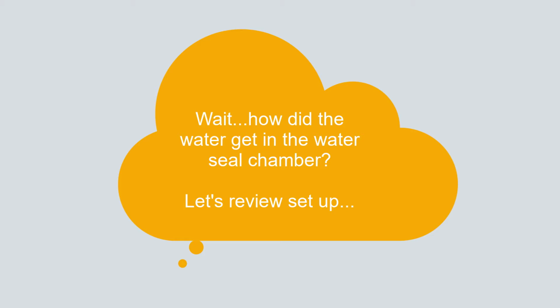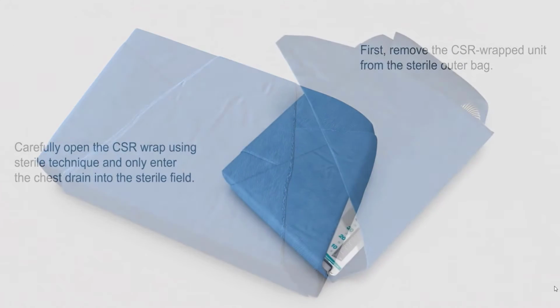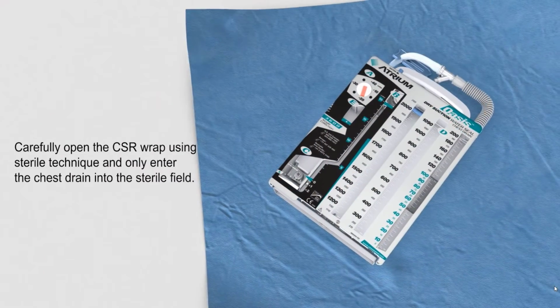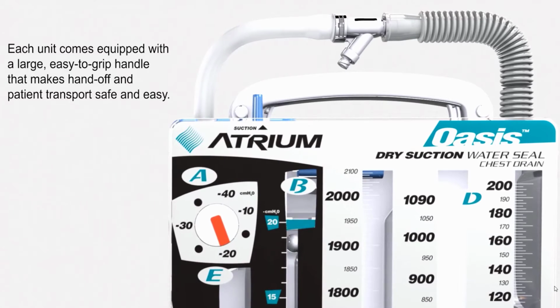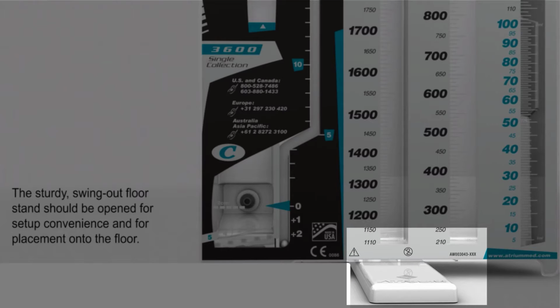Let's talk about chest drainage system setup. Remove the wrapped unit from the sterile outer bag. Carefully open the CSR wrap using sterile technique and only enter the chest drain into the sterile field. Each unit comes equipped with a large, easy-to-grip handle that makes handoff and patient transport safe and easy. The sturdy swing-out floor stand should be open for setup convenience and for placement onto the floor.